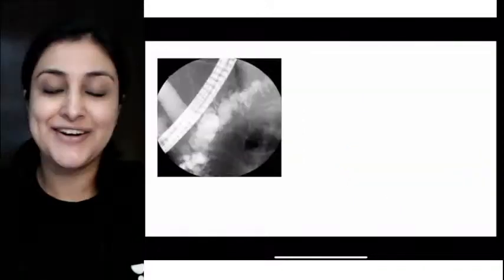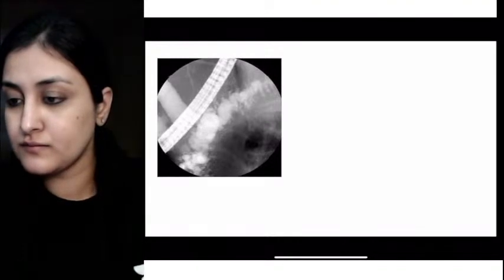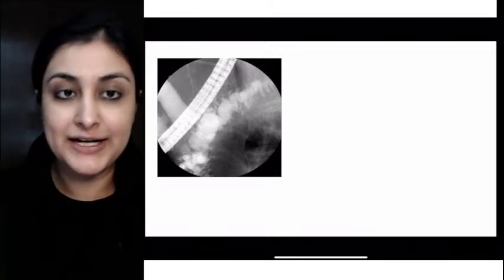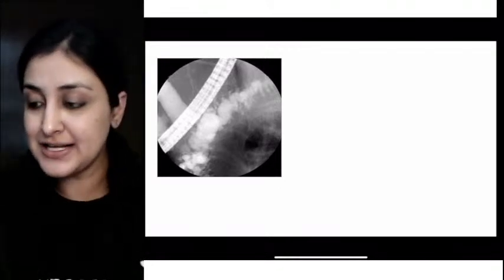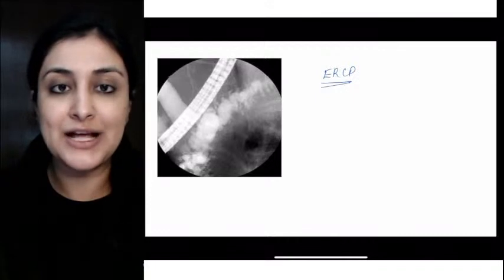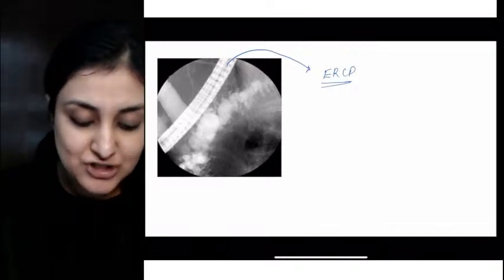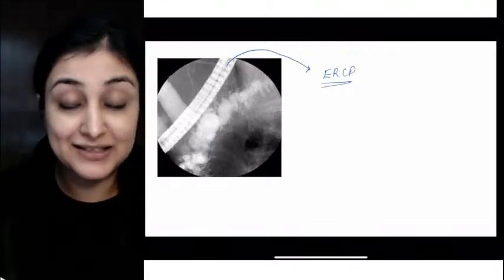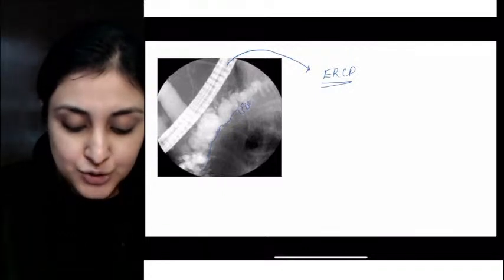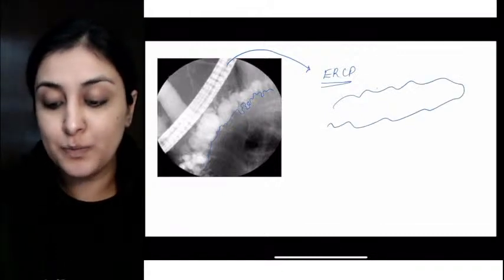Try and identify the investigation. This is not HSG but this is also a contrast study. So here, what is this last image? What we are having here is ERCP, endoscopic retrograde cholangiopancreatography. How do we know? It is on the basis of this white endoscope. What we are actually seeing is the pancreatic duct. So I have focused on the pancreatic duct. Is it normally so dilated? No. We are seeing it is very dilated and all of these side branches have opened up. A dilated pancreatic duct with opening of the side branches, that is called a chain of lakes appearance.